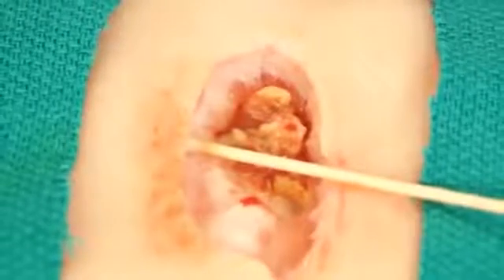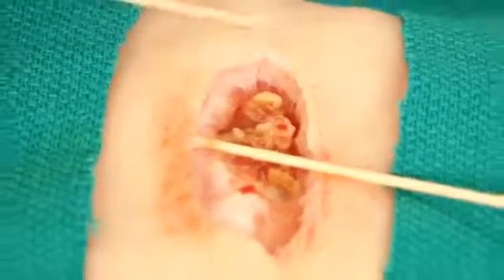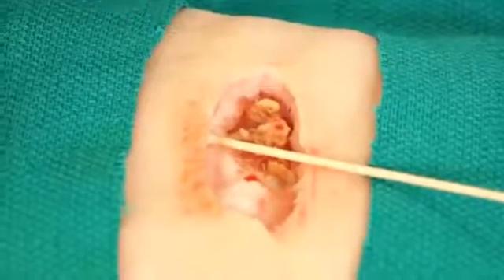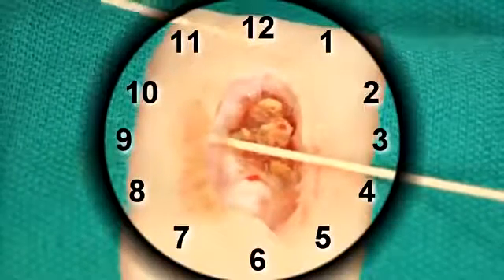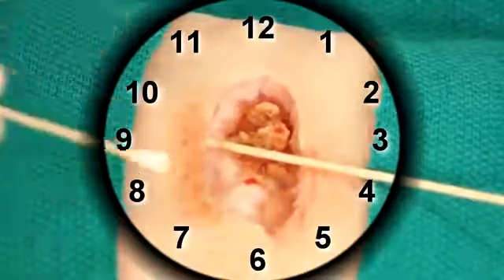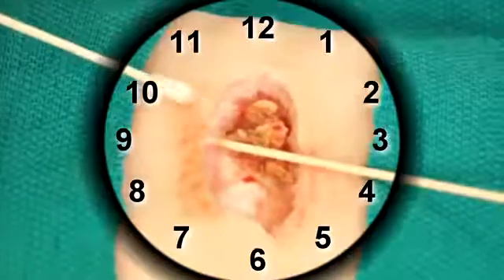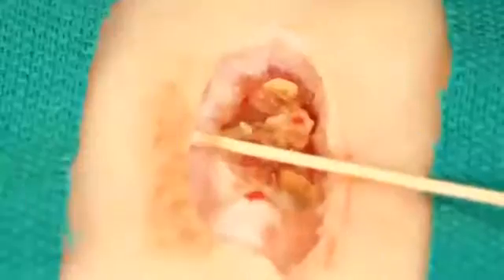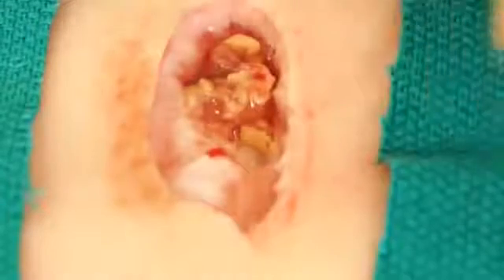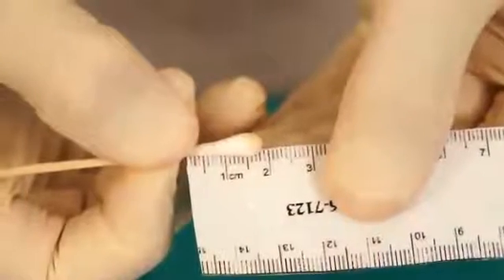As you can see, by convention, the superior aspect of the wound, or the head aspect of the wound, would be 12 o'clock. If we then progress clockwise around a clock face, the area of maximum undermining is approximately 10 o'clock. Similar to how we measured the depth of the wound, you would want to slide your finger down the cotton-tipped applicator, pinch it with your nail, and then bring it up to your measuring device.